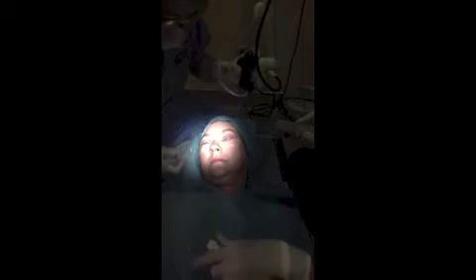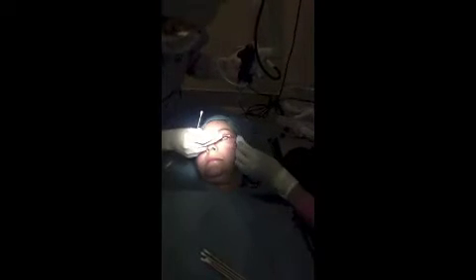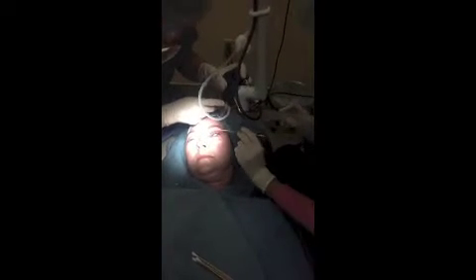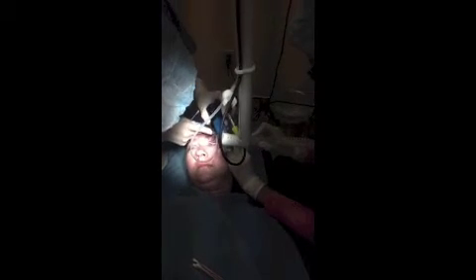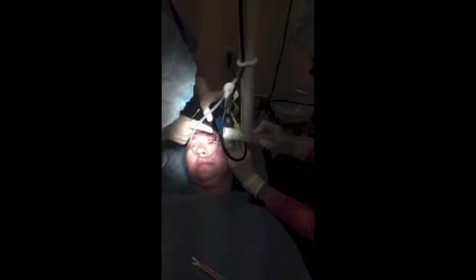Back over here. Don't ever want to forget the lash line. Are you able to see how her skin is tightening with that video? Be able to pick it up maybe better with the active. That's my whole frame.